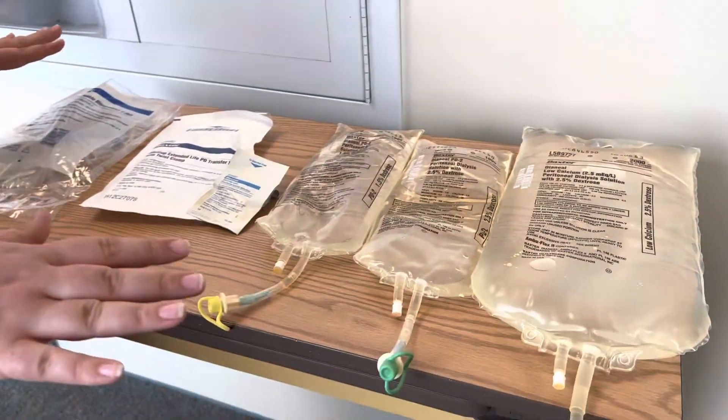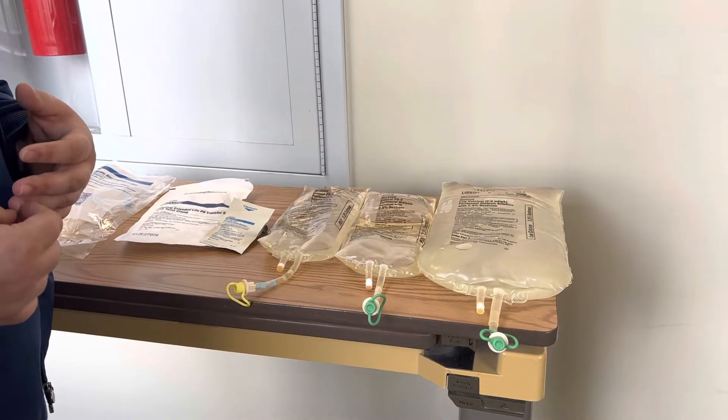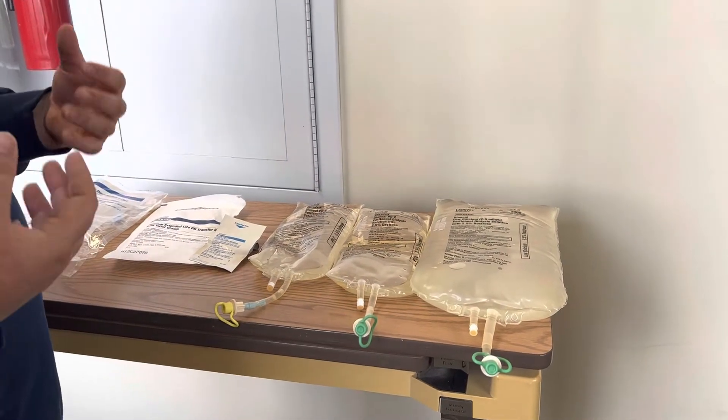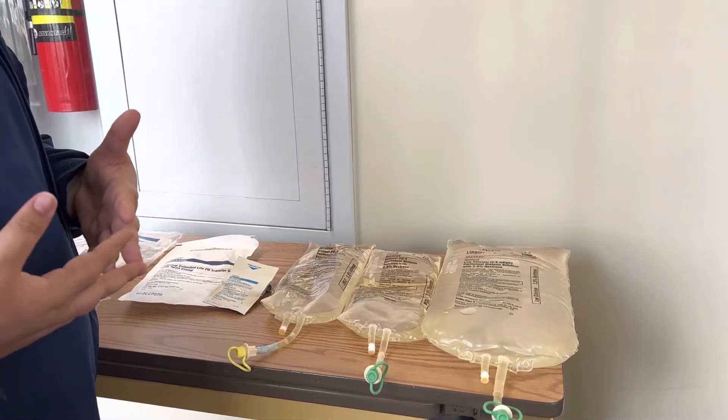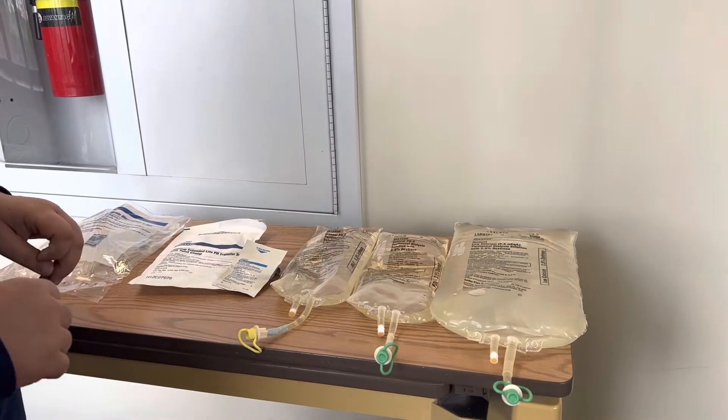Once you have these, a couple of other things to remember — it is a sterile procedure, so you do want to have sterile gloves, you want to make sure you're putting on a mask for the patient and yourself, and any visitors that are coming should also have a mask.